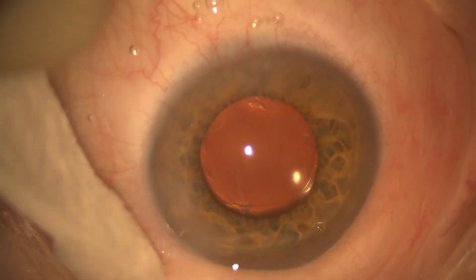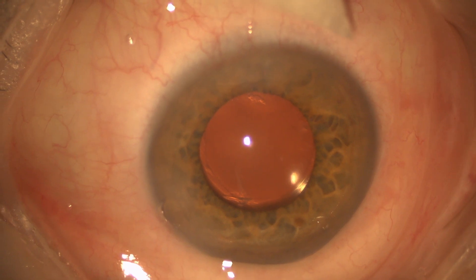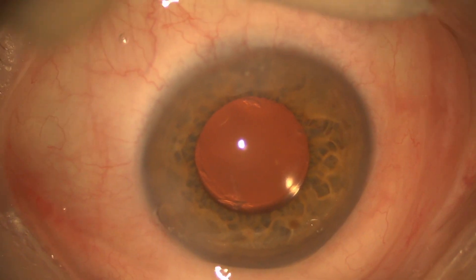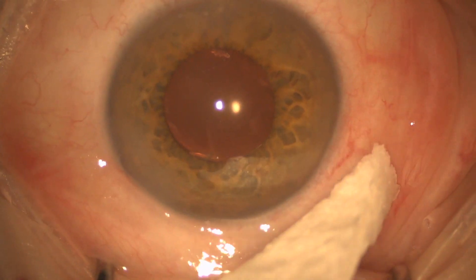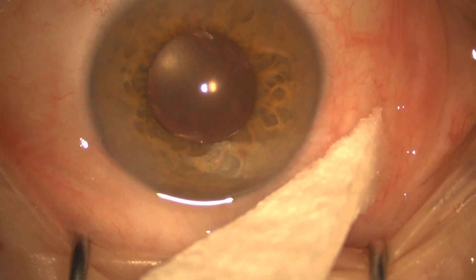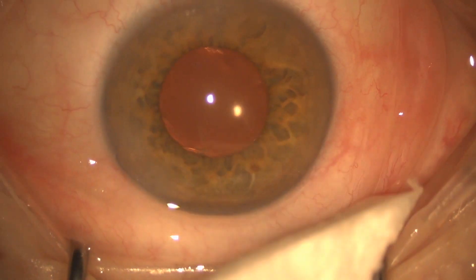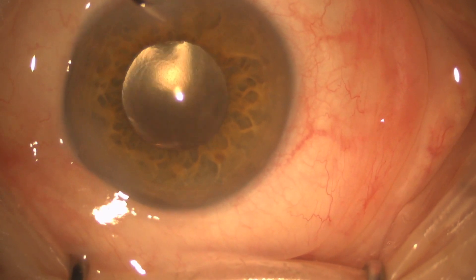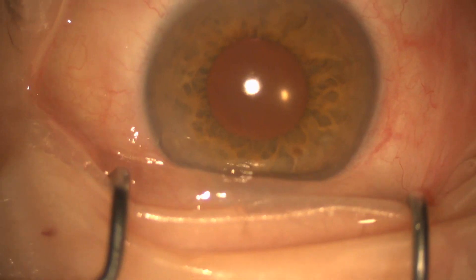This helps check for a peaked pupil. Another option that I didn't use on this case but could have is to stain with Triessence to be able to see the vitreous. Here I'm just checking to make sure that my wounds are intact and that there's no vitreous at the wounds. You can see a nice round pupil and you can barely see any vitreous — it's all behind the iris at the equator of the eye. I decided not to do an anterior vitrectomy in this case. I think if it's equatorial vitreous, a lot of times you can get away without doing an anterior vitrectomy. Here I'm putting in a generous amount of Vigamox to the anterior chamber, and in this case the patient did not require any sutures. I checked the wounds multiple times and this concludes my case.